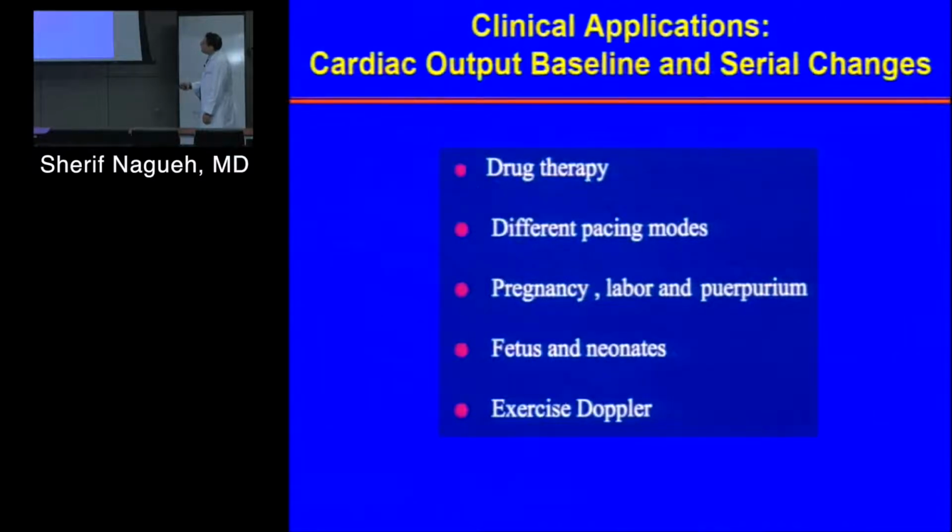This approach has been used to look at the effect of drugs on patients in heart failure, and to look at the effect of different pacing modes, VVI versus AV sequential pacing. How do we adjust the AV delay? How do we look at the VV delay? Things like that. These are all very vivid applications of that principle.